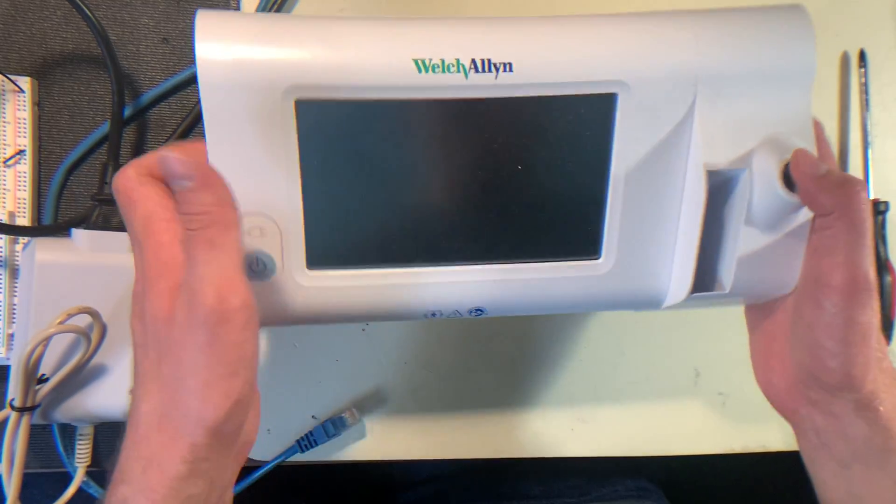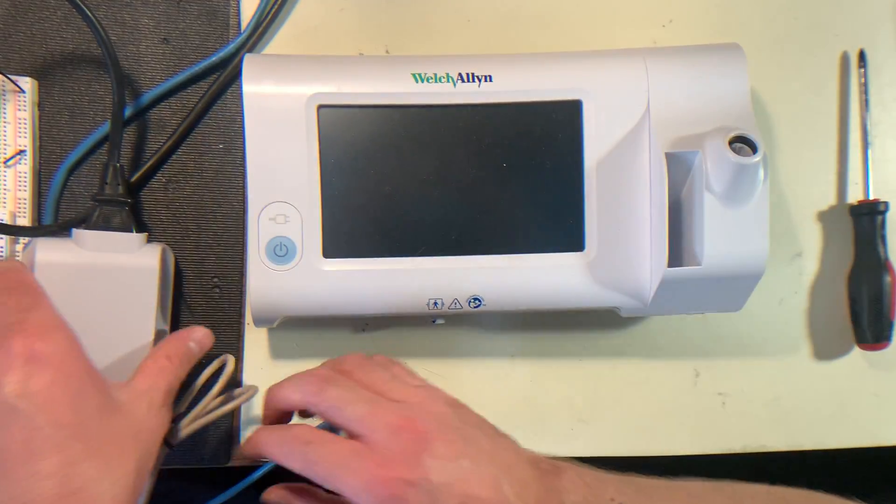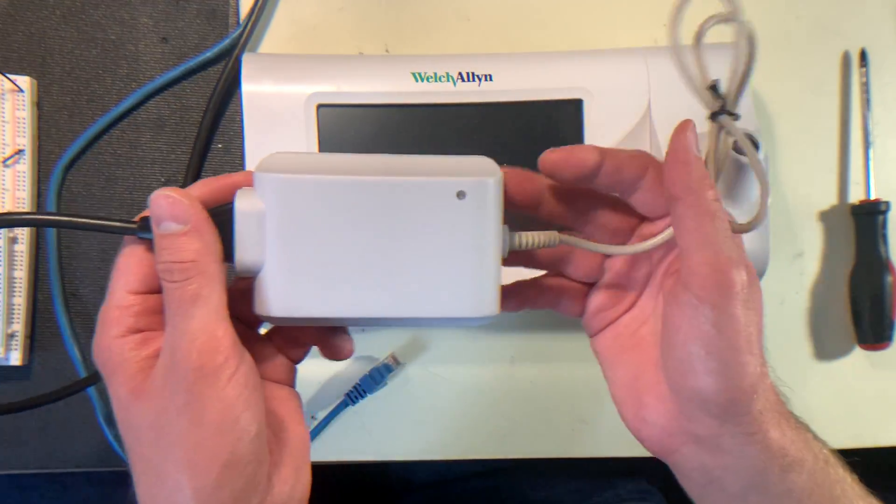So the Welsh Allen itself also comes with a power supply that looks like this.